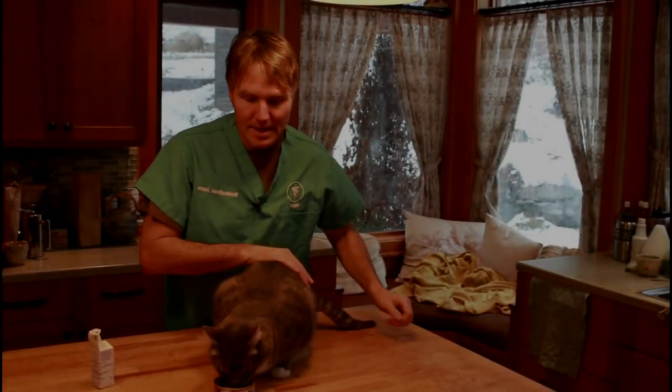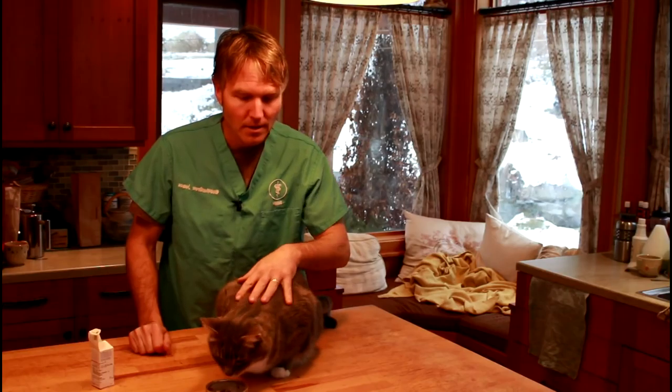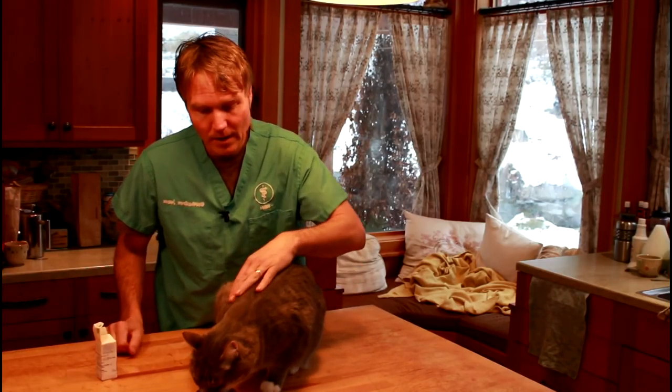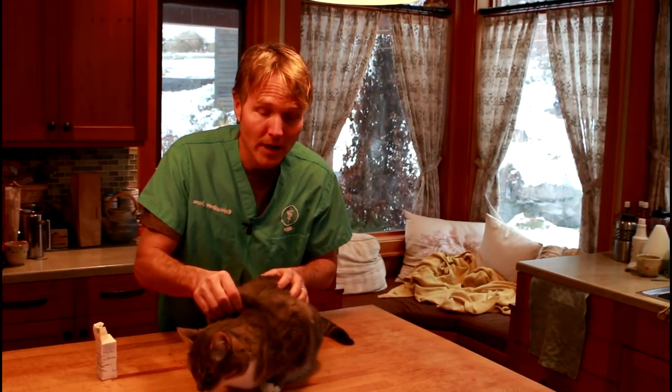Third, I want to show you exactly where I do the bulk of the injections. For the majority of the time, whether it's subcutaneous fluids or insulin as we're about to give Murray, I want you to choose an area of your dog or cat's body where there's a lot of subcutaneous skin. A really easy one is up here between the shoulder blades at the back of their neck.